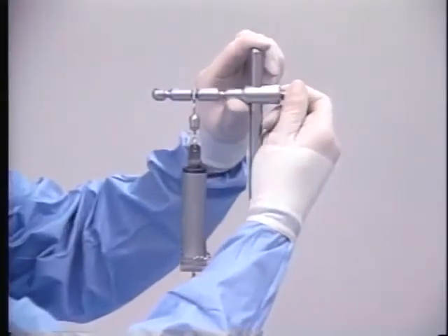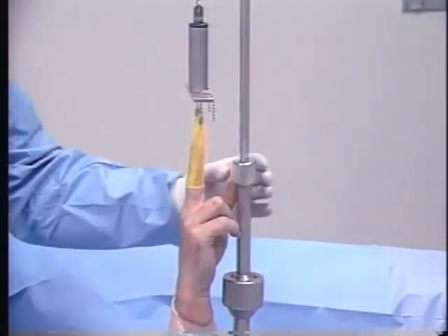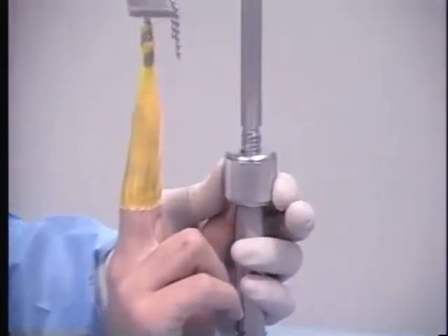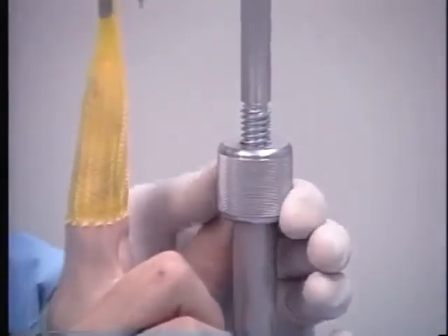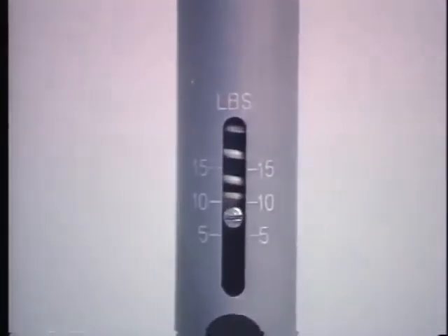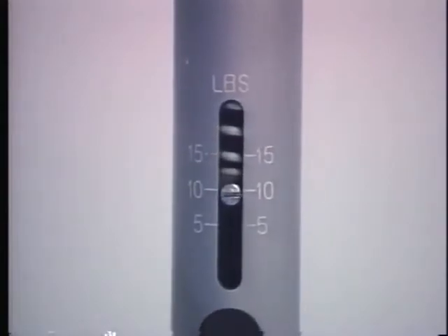The upper macro adjustment pin is used to obtain initial distraction. Additional distraction is applied by using the micro adjustment knob attached to the traction rod. Clockwise rotation of the micro adjustment knob increases distraction, which is displayed in pounds on the traction scale. Rarely is over 10 pounds of traction force required.